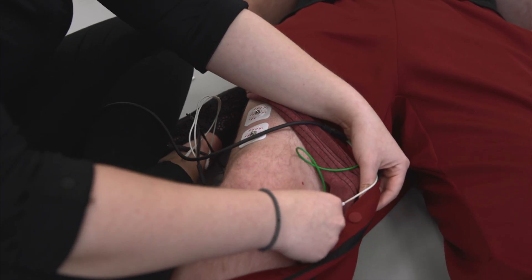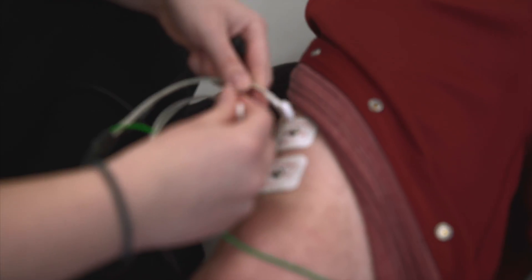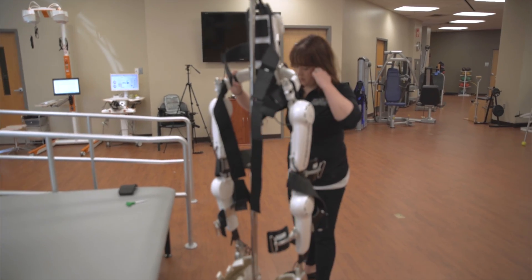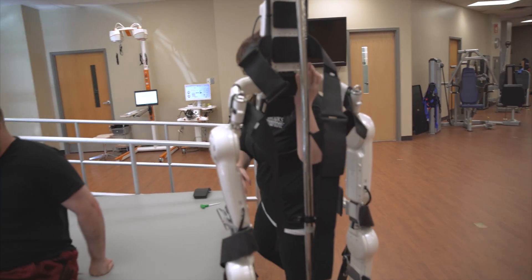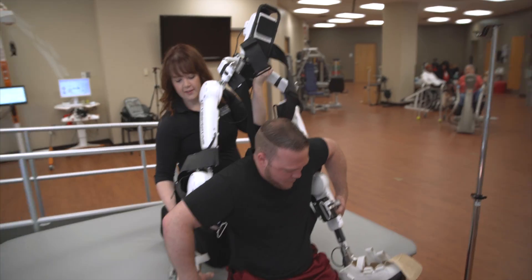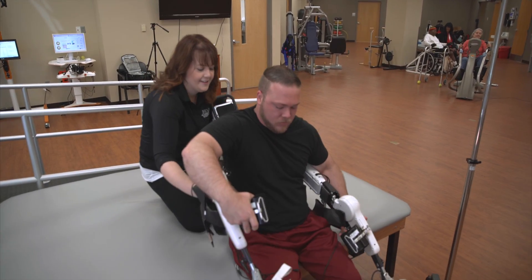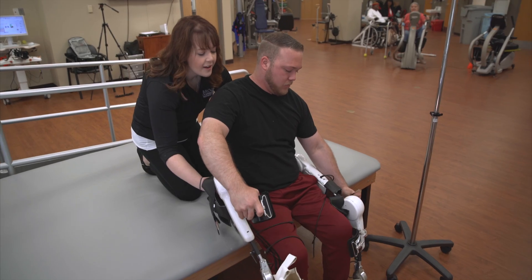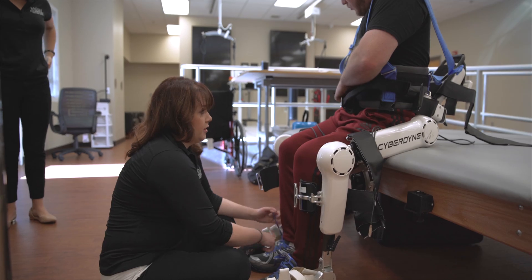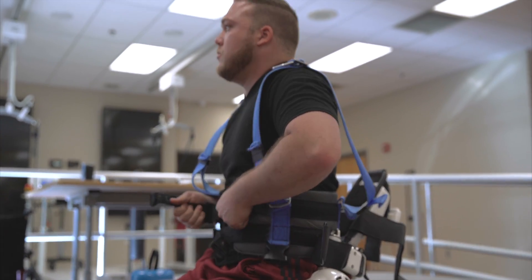These are the leads that hook up to the electrodes. Now we're going to start by putting the suit on. Maverick is very helpful and experienced in how it goes on. Maverick is putting on his harness — the robot has to be used in a body weight support harness for everyone.